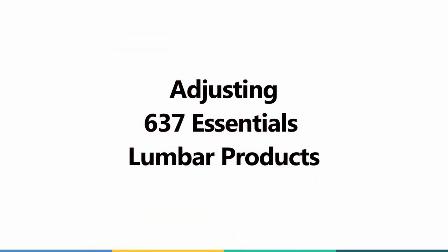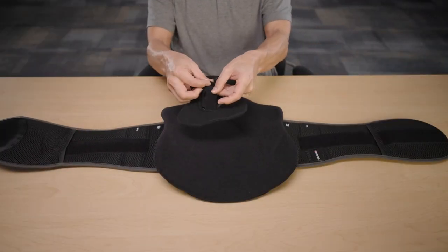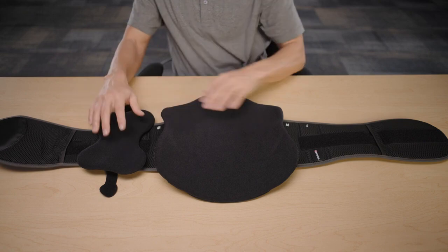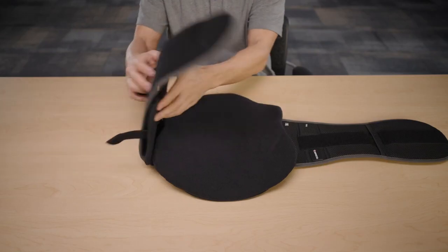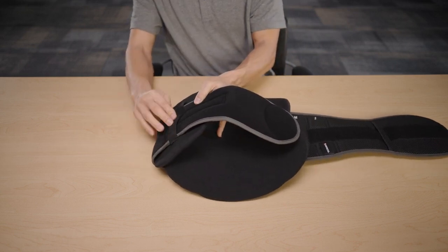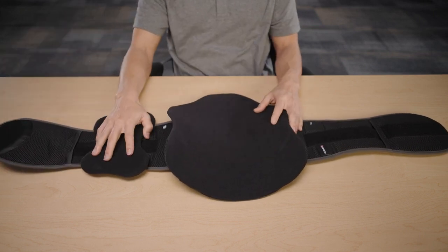For the 637 model, lateral pads are included for additional lateral support. Start by opening the straps, then place the pads so that the long edge is adjacent to the center of the brace. Flip the belt over and wrap the straps around the belt, then repeat on the other side.